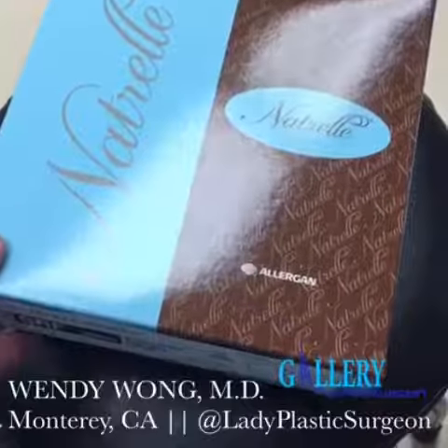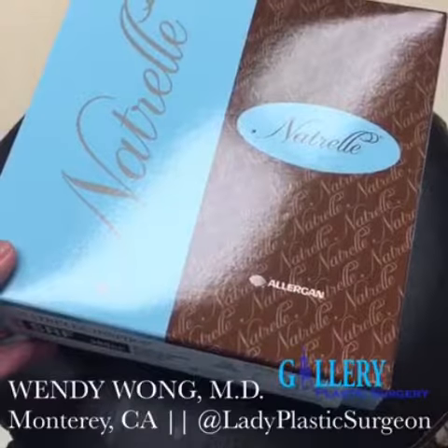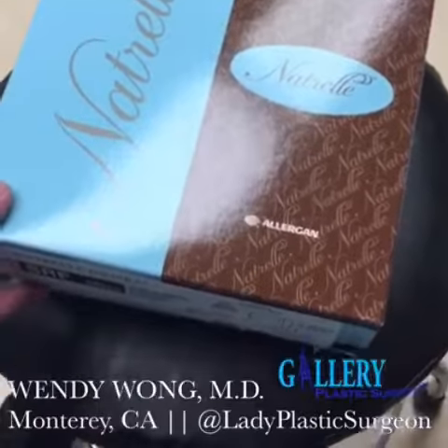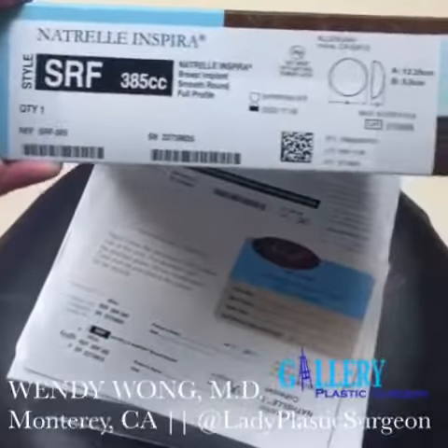This is how implants come — they usually come in a box. Today I'm using a Natrelle made by Allergan. I only use FDA approved medical devices. Once I open the box, you can see there's a lot of information.